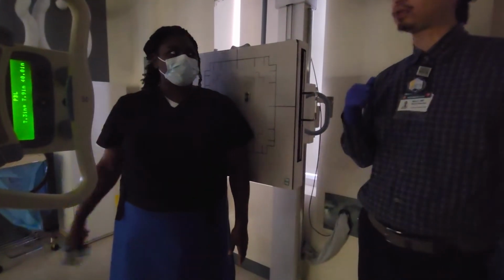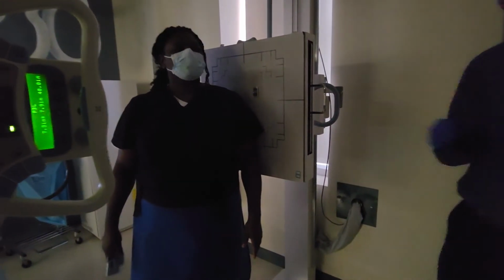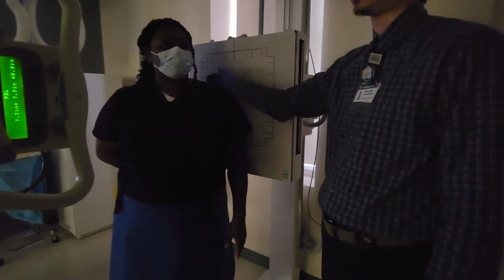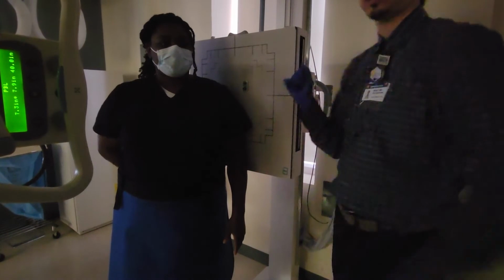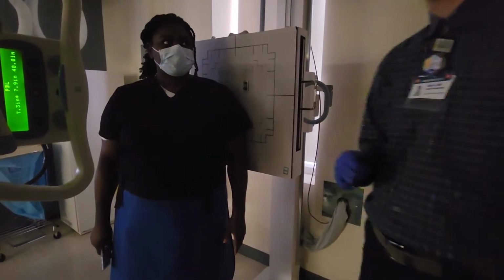This is actually what I would say is the opposite of the Y view, because you're taking the scapula and you're basically putting the scapula parallel to the IR. When you do the Y view, you're taking that scapula and putting it perpendicular to the IR. So let's do that trauma Y view.